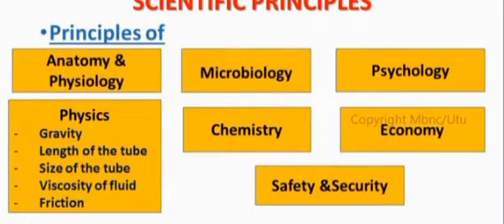Third principle, principle of psychology. We have to explain the procedure to the patient if the patient is conscious, and if the patient is unconscious, we have to explain the procedure to the family members. It helps with cooperation from the patient as well as from the family members. We also explain that while we are inserting the tube, it can lead to discomfort, restlessness and breathing difficulty. The patient should be mentally ready, and we advise the patient to try to swallow for easy insertion.